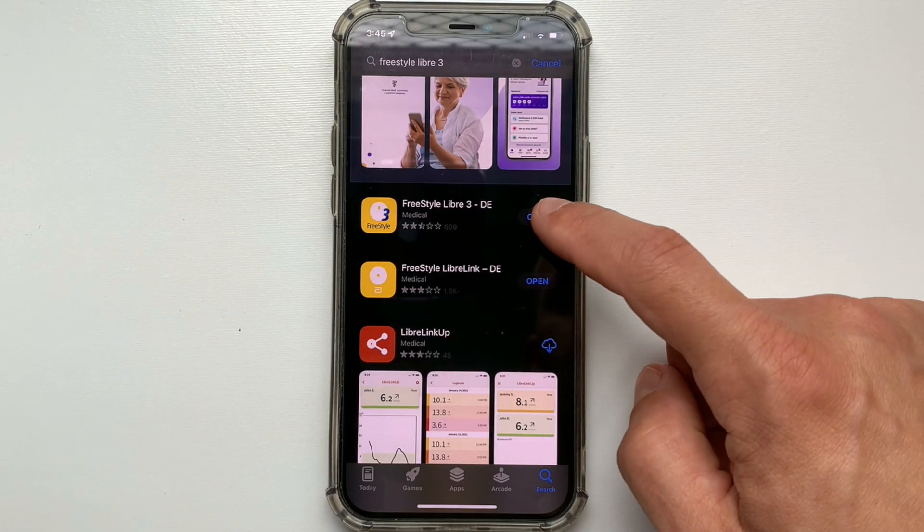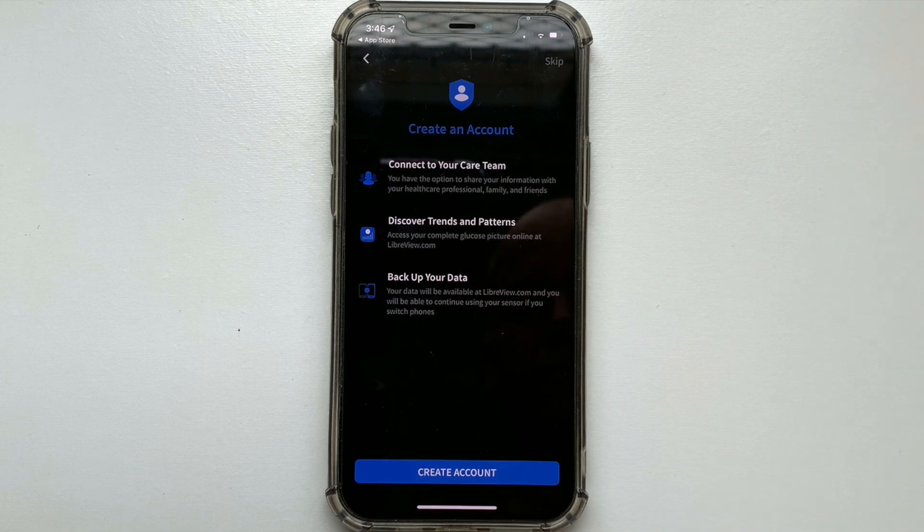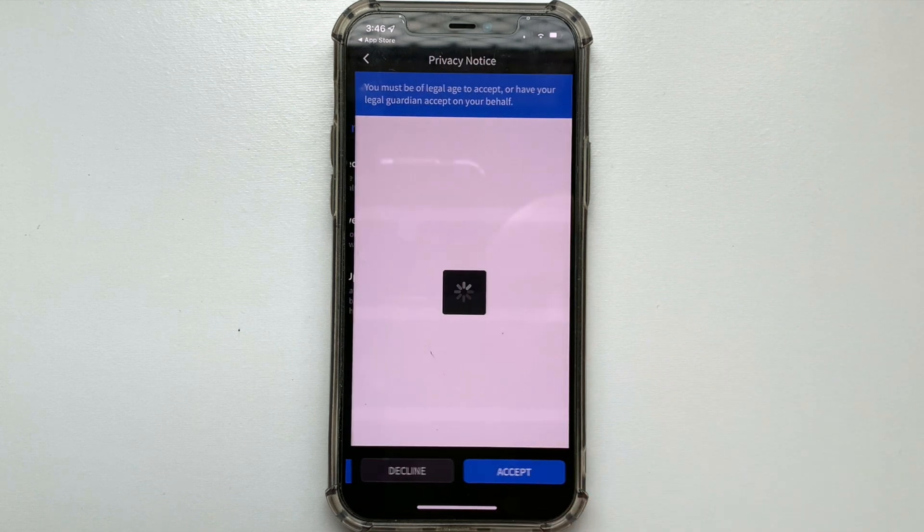You can download and install the Freestyle Libre 3 app directly from the Apple Store or Google Store. If you already have a Freestyle Libre account, sign in with your existing credentials. If not, simply create a new account.